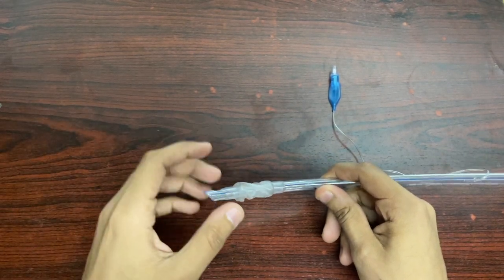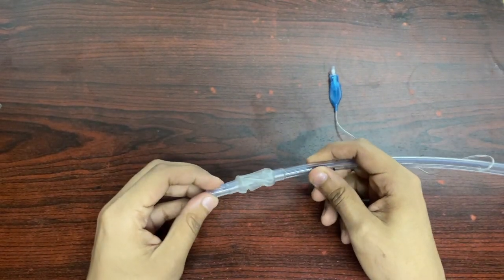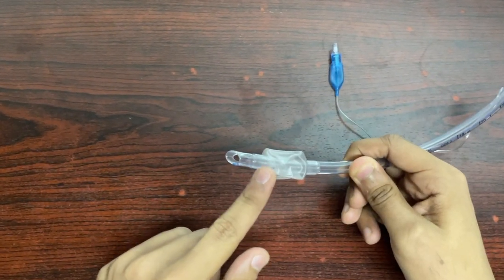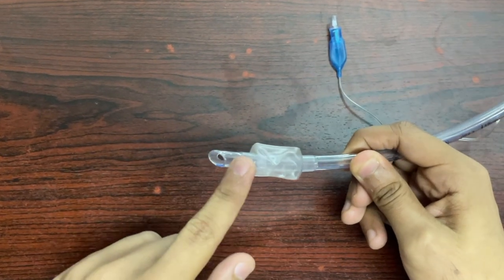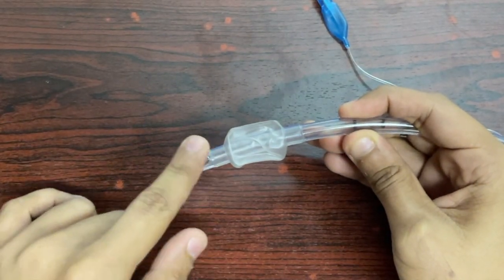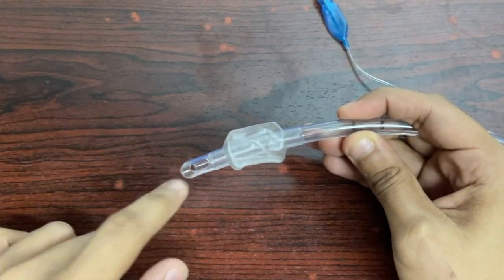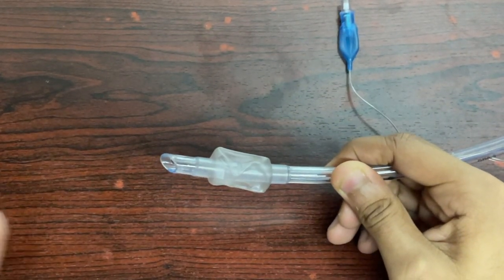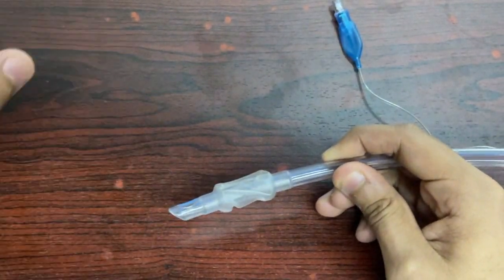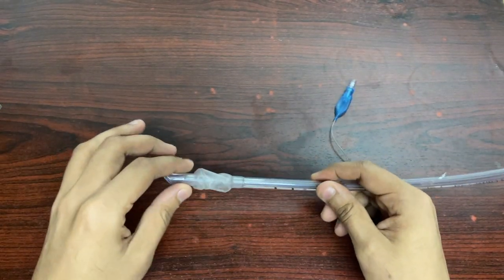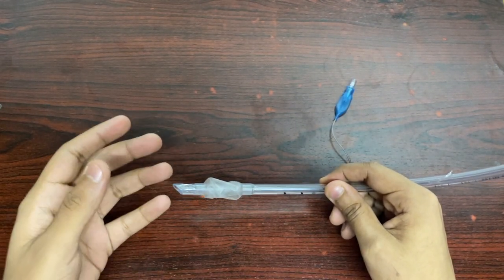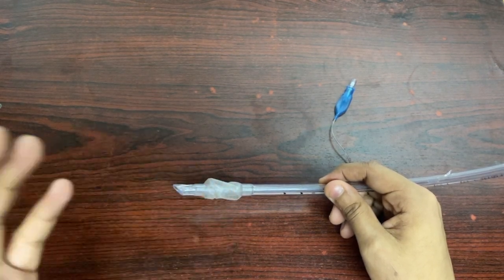The distal part of the endotracheal tube has a non-traumatic beveled end. We can see that the terminal section is open and the beveling is towards the left side. Also, a sub-terminal opening towards the right side is provided for equal and bilateral ventilation of both the left and right lungs. Just before the two openings we have the cuff of the endotracheal tube. Endotracheal tubes are available in uncuffed varieties as well.